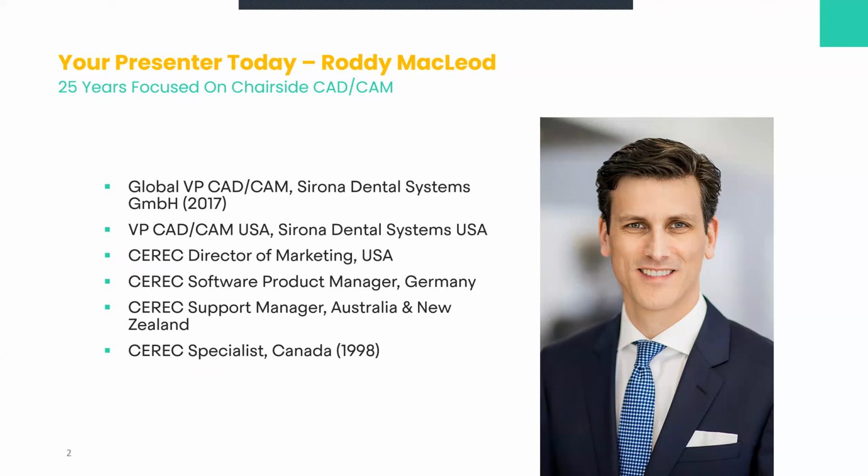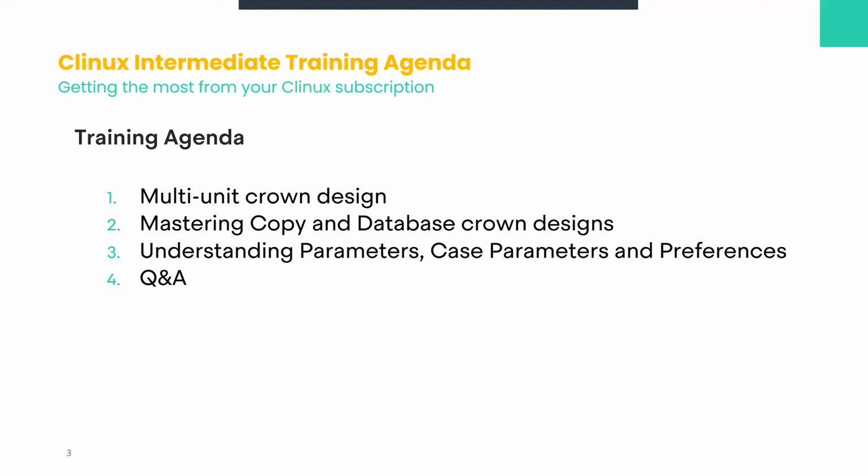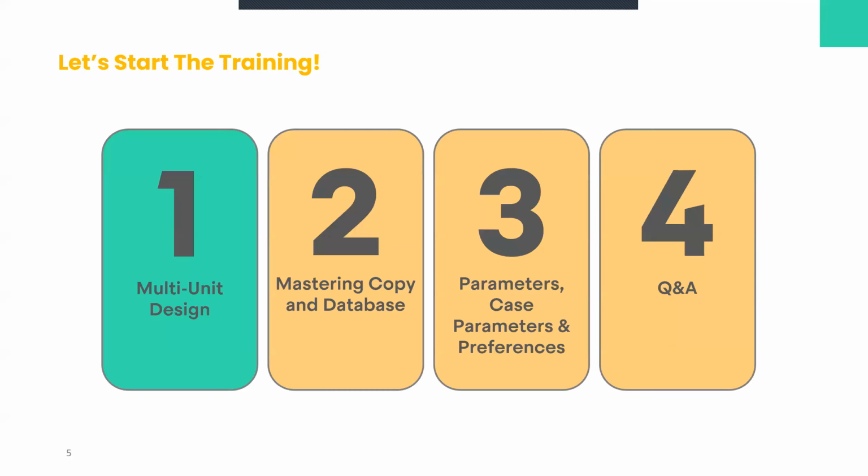And today, what we want to do, as I mentioned, is make sure that you get the most out of your Clinux subscription. This is the whole idea of this training. Actually, our goal for this training is that you just become more comfortable in your day-to-day work with Clinux. I'm going to show you some new applications. I'm going to show you some tips and tricks, and we're going to understand the software a little bit better. But as I mentioned, the whole idea here is that your day-to-day Clinux work becomes very simple and routine for you, and you know exactly what you want to do and when. So this is the whole idea. So let's go ahead and get started with multi-unit crown design.